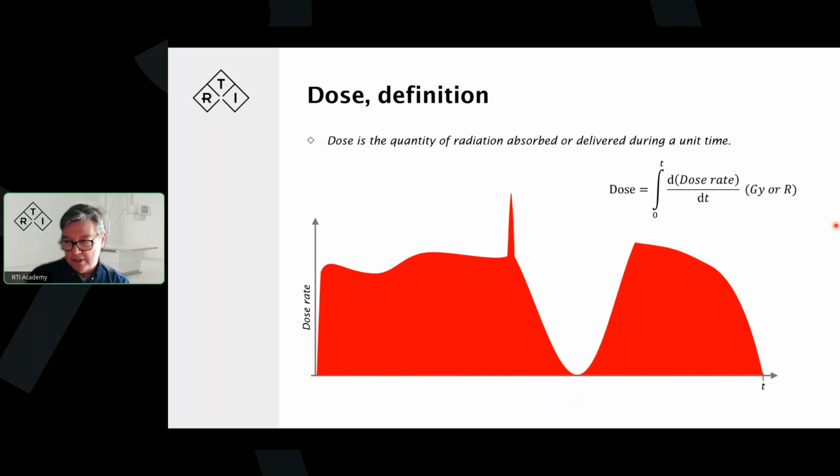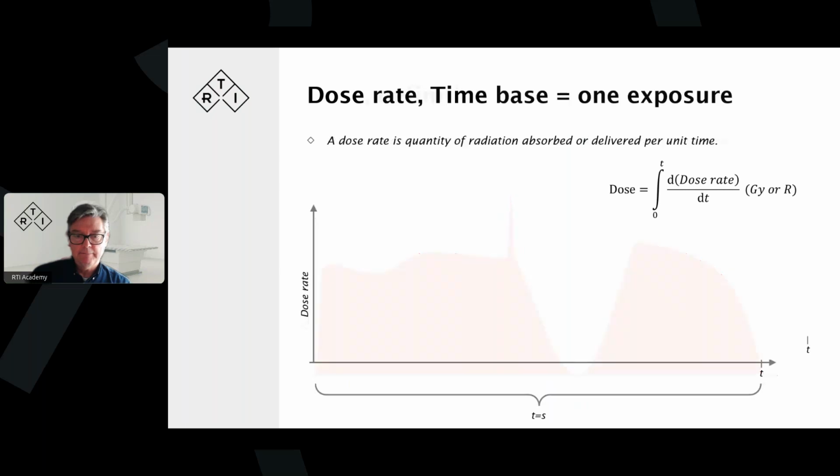This might be one of the explanations for why we're seeing dose rate or peak dose rate values: the scatter probe picks up this short event, but it's insignificant really in comparison to others, and other probes may not see that event.